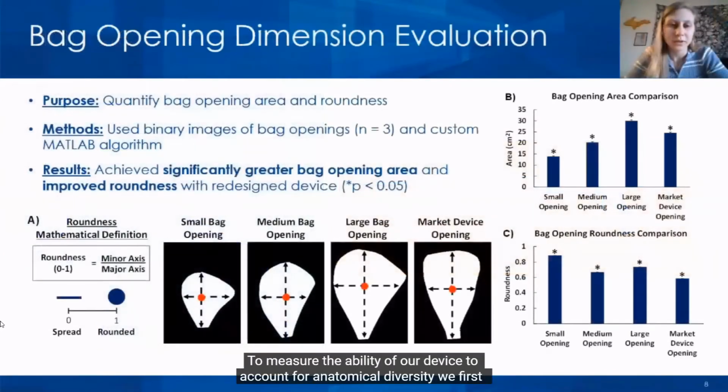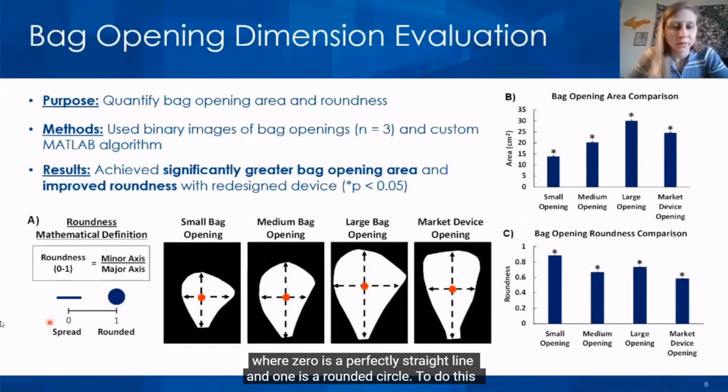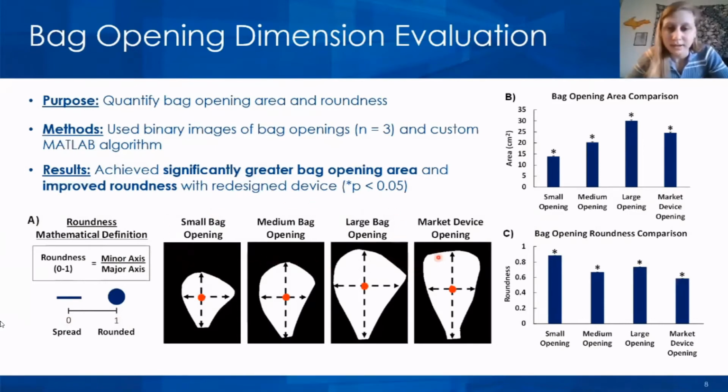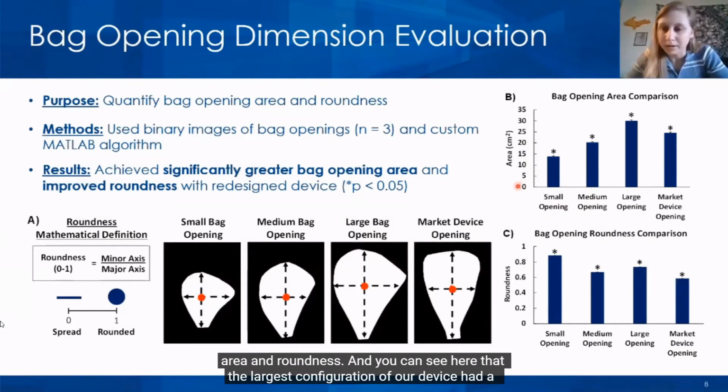To measure the ability of our device to account for anatomical diversity, we first quantified bag opening area and roundness. Bag opening roundness is a number from 0 to 1, where 0 is a perfectly straight line and 1 is a rounded circle. To do this, we took images of the different bag opening configurations from our device and a market device. These images were imported into MATLAB, where we could quantify bag opening area and roundness.